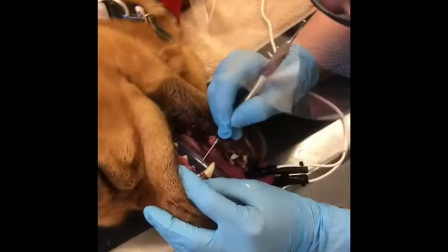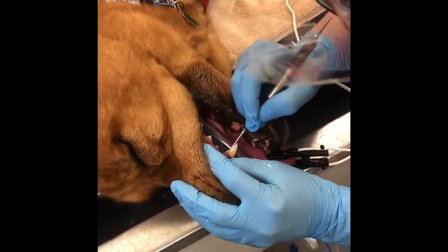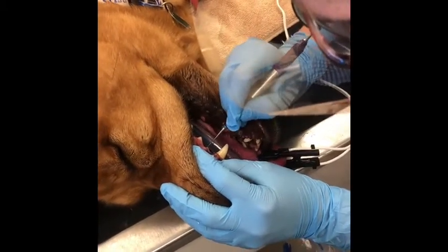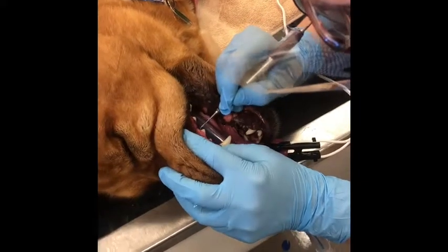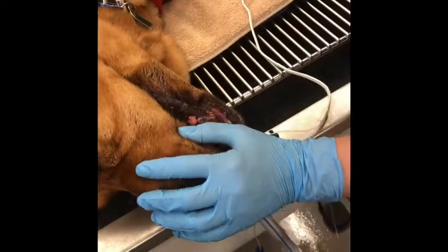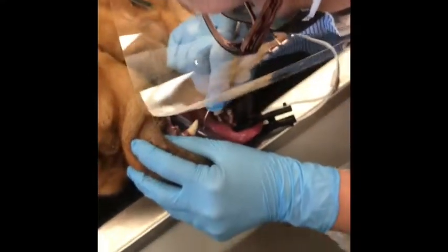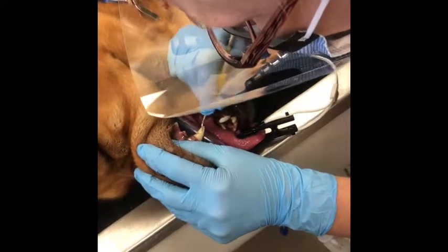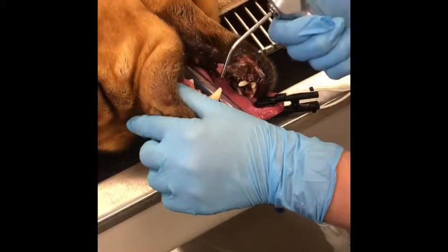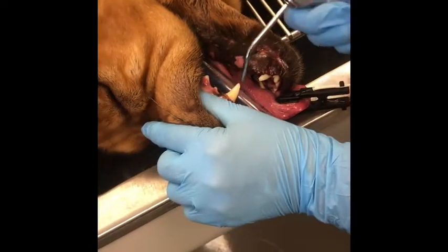Hand scale the tooth and try to get any kind of stubborn calculus. I'm going to take our curette gently, put that under the gum, and we're going to go ahead and check to make sure that we got all the stuff from underneath that gum line.